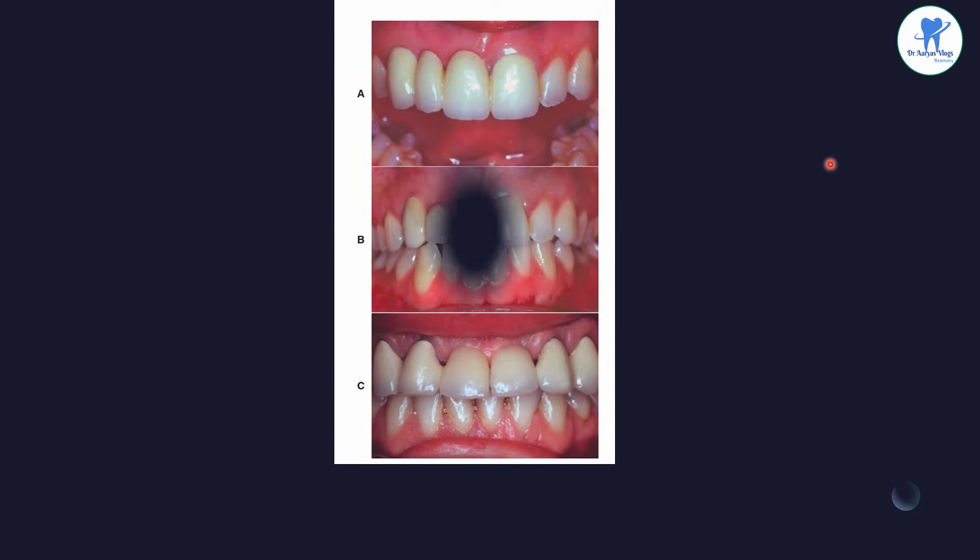This is the picture showing correct incisor gingival height, which is critical in aesthetic pontic design. Here is the aesthetic failure of a 4-unit fixed dental prosthesis, which is replacing the right central and lateral incisors. The pontics have been shaped to follow the facial contour of the missing teeth. Because of the bone loss, they look too long.